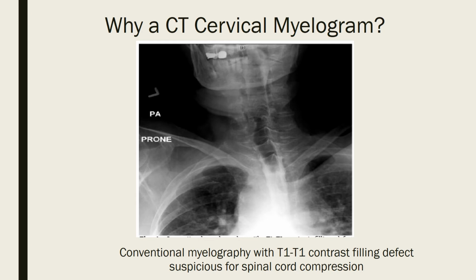The doctor ordered a CT cervical myelogram. I'm not completely positive why or how he decided to order this exam. There wasn't any information regarding whether the patient had any other scans during her visit that would warrant the doctor wanting to order this exam.